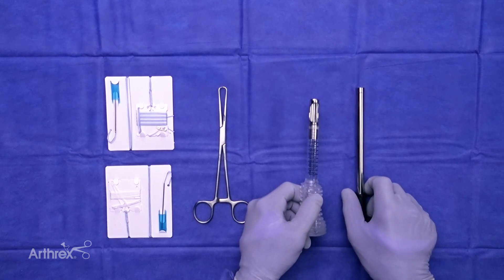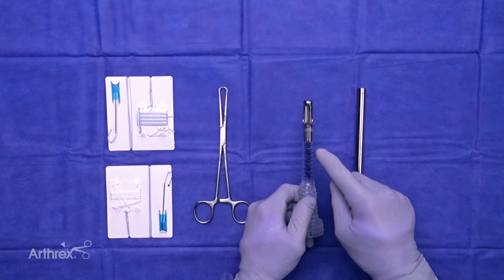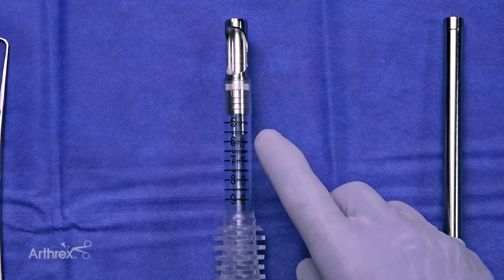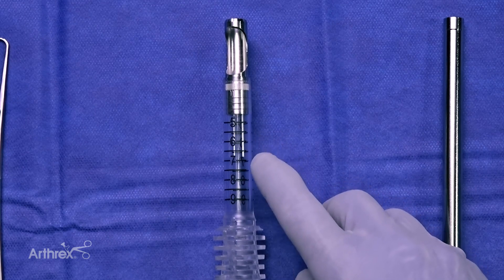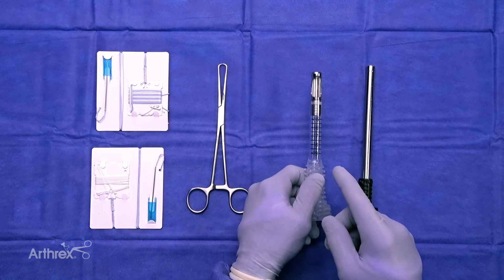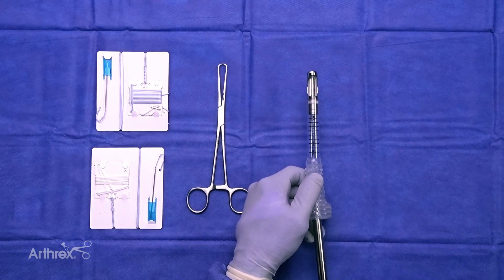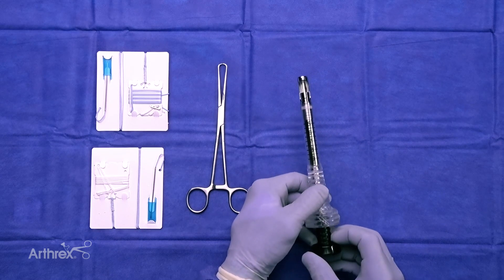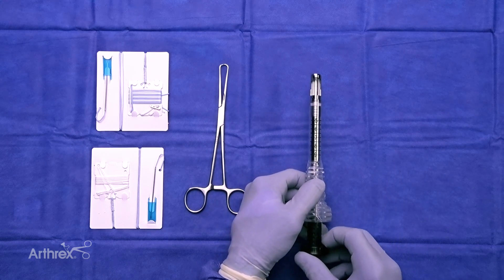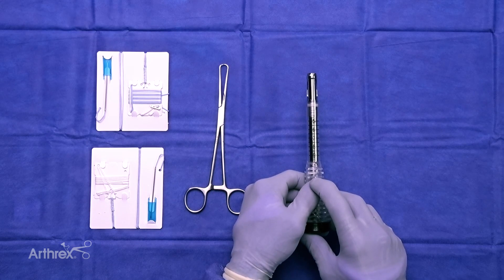Here on the table is the insert to the handle of the quad tendon harvester. We have a size 11 here. The harvester tube itself has graduated numbers starting at 50 millimeters, 60, 70, all the way up to 90 if you can find a graft that long. There is a harvesting window that allows you to visualize the stripper as it travels up through the tendon, and the push rod integrates into the harvester to perform the final cut once the desired length is reached.